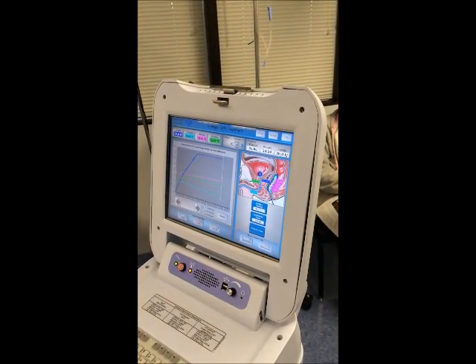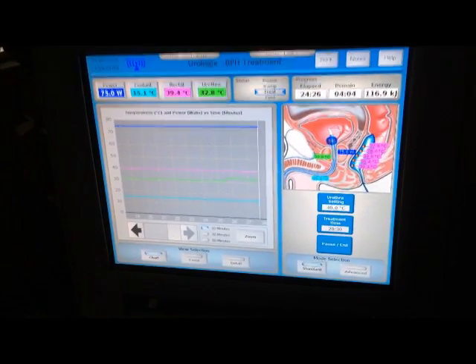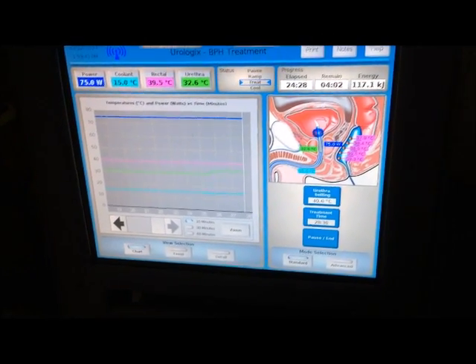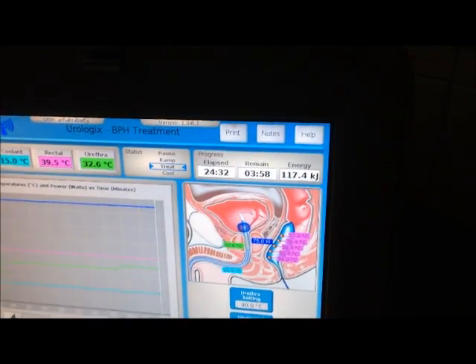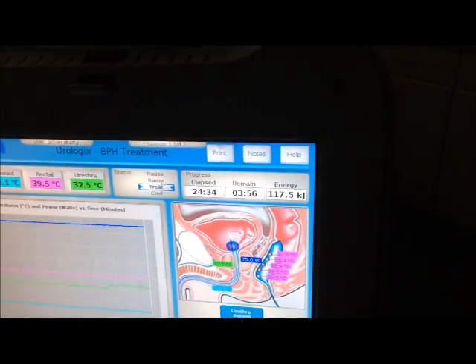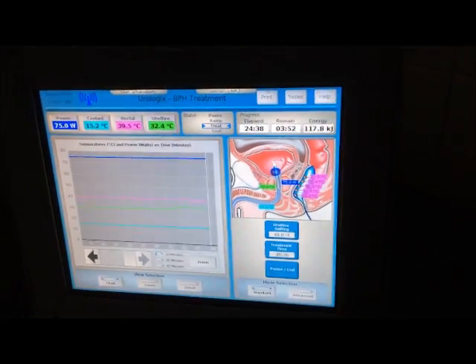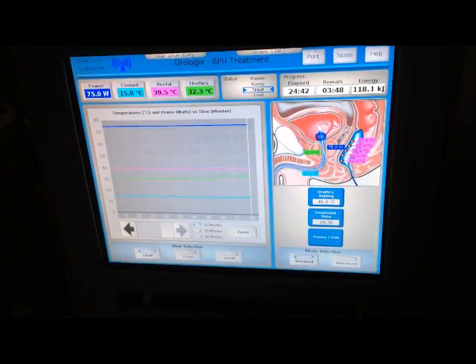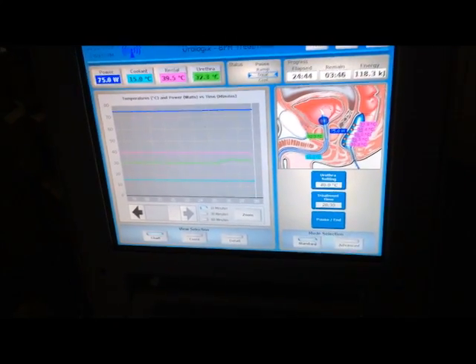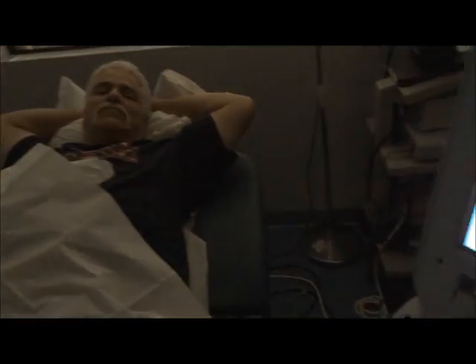The treatment continues calmly. We are coming to about the end of the treatment. Energy usage is quite high due to the prostate size being about 80 grams, but everything is in a straight line, which is the way we like it.